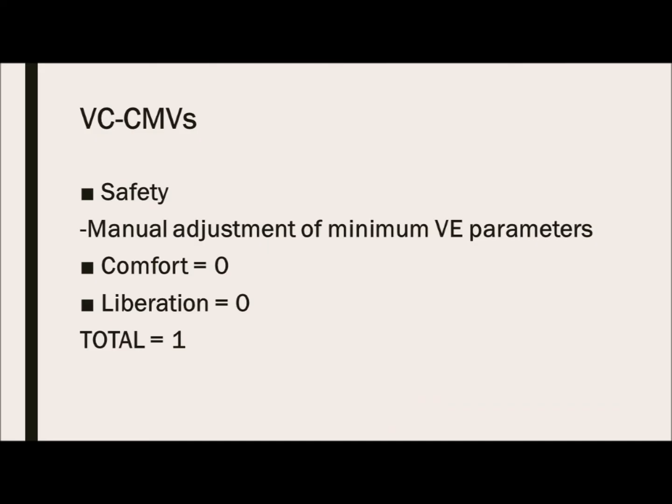The main advantage is with this simplicity during the acute phase of illness or during surgical procedures, the operator can manually adjust the minimum minute ventilation parameters. However, after this acute phase of illness or after the surgical procedure, there is no clinical benefit. It provides no comfort and does not optimize the liberation experience.